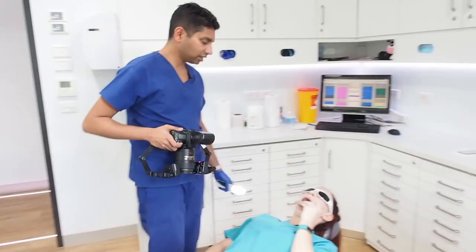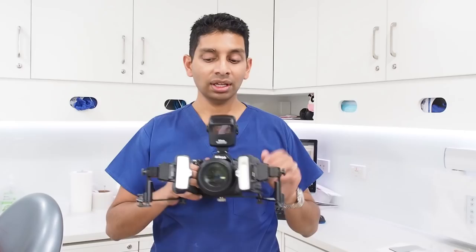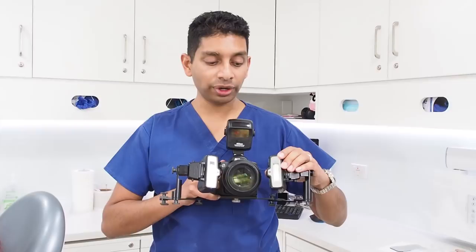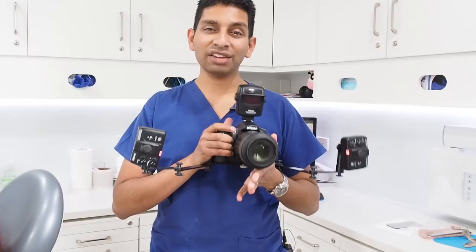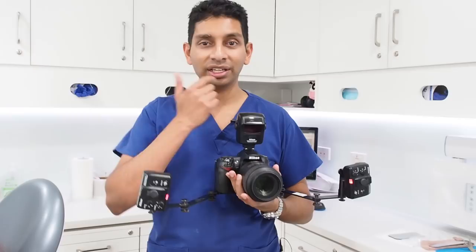The advantage of this dual point flash system over a ring flash is that there are two points of light. I can turn it away and bounce the light off the ceiling and off the floor, which gives a more flattering image for extraoral photos. For intraoral shots, rather than a big ring light at the front, you only get two small lights on the side, giving your technician more information. That said, the ring flash is easier if you're first starting out — you don't have to worry about the angulation.